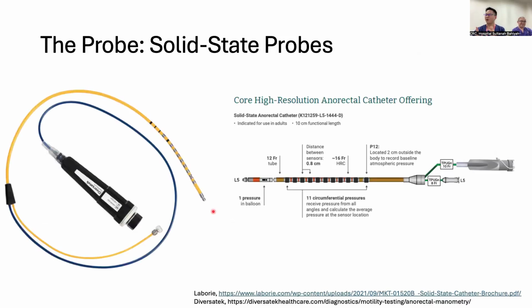So, let's start off with the probe. I put up two probes over here, one by Diversatek on the left and Laborie on the right.